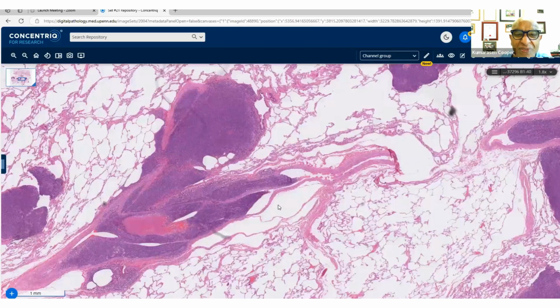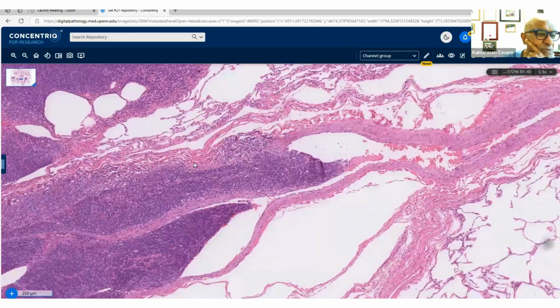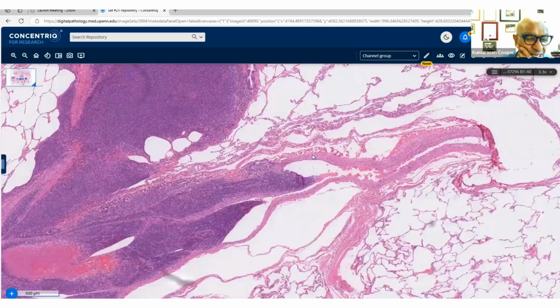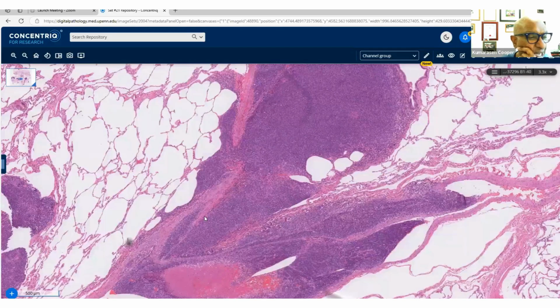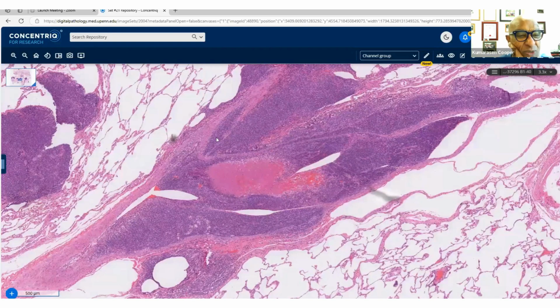Yeah, it's also very close to vessels. Yeah, I never noticed that so closely before. I always do that when I go back to South Africa and Africa. I'm showing slides and I notice different morphologies. Here, there's some necrosis as well.